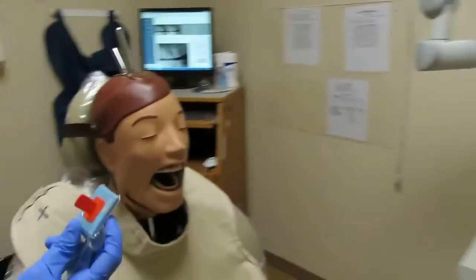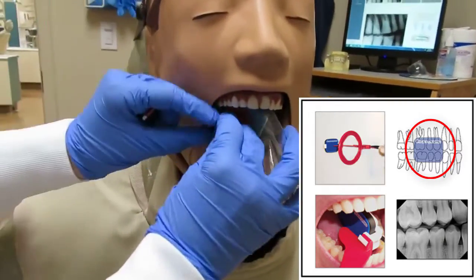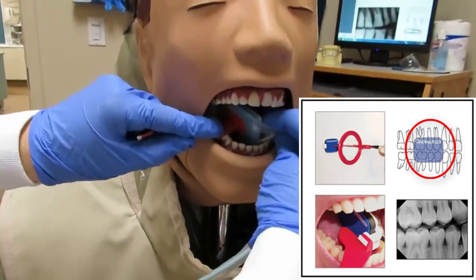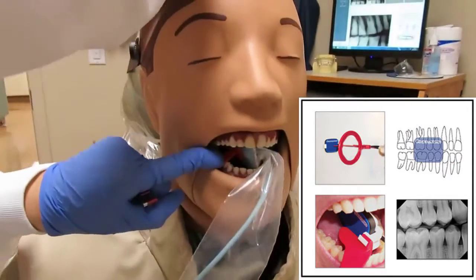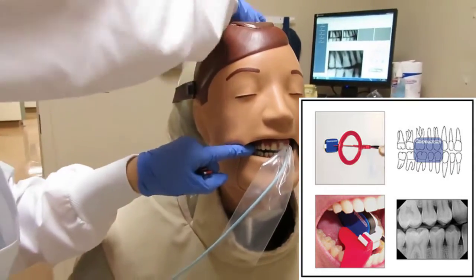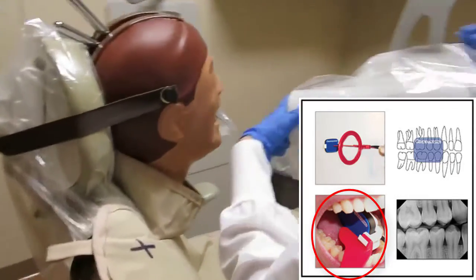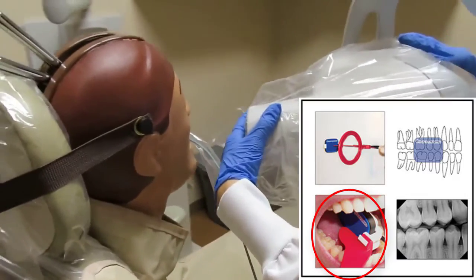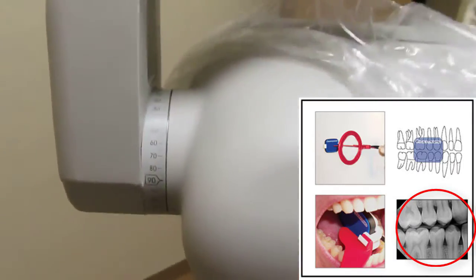To properly align the film, center the receptor on the mandibular second premolar, making sure that the front edge of the receptor is aligned with the midline of the mandibular canine to ensure the film includes both premolars and the distal aspect of the canine.